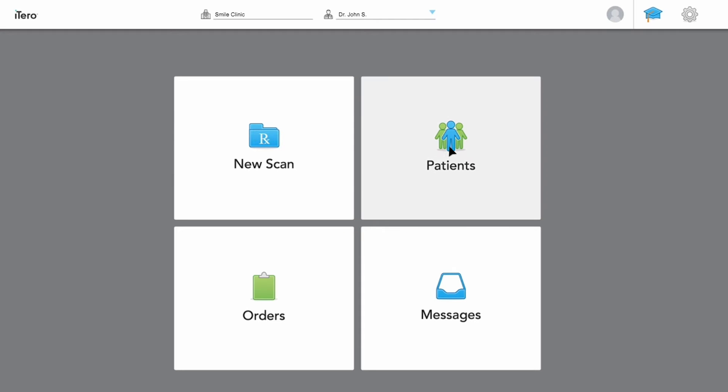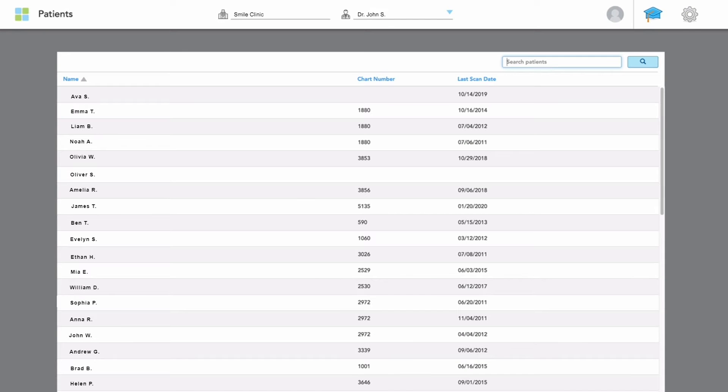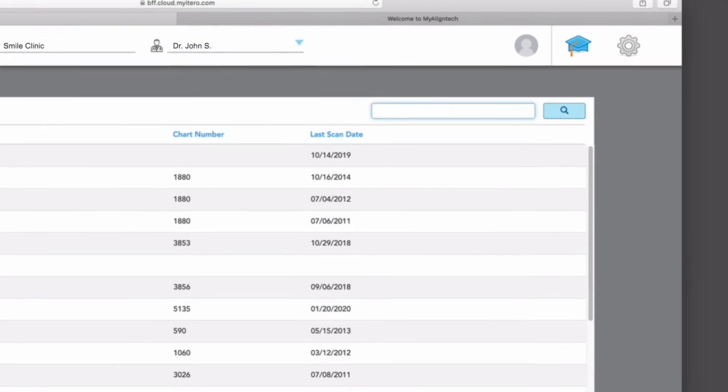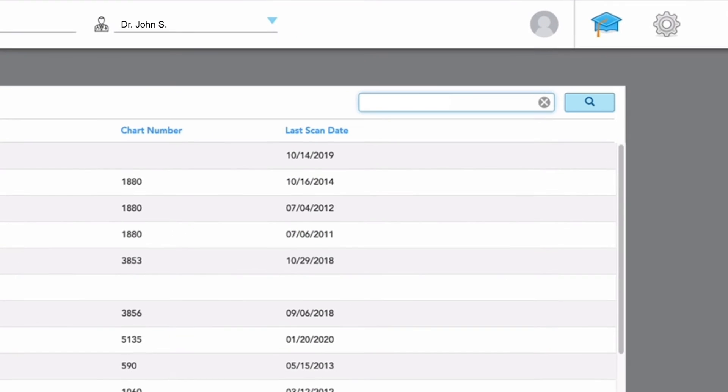Click on Patients. Go to the order list showing all recent scans. In the search field, type the patient's name. If this doesn't display any results, check that you're choosing the correct scanner location.